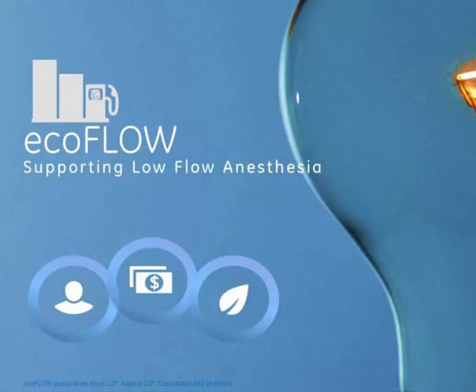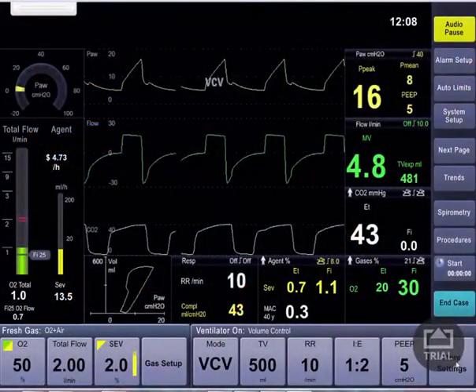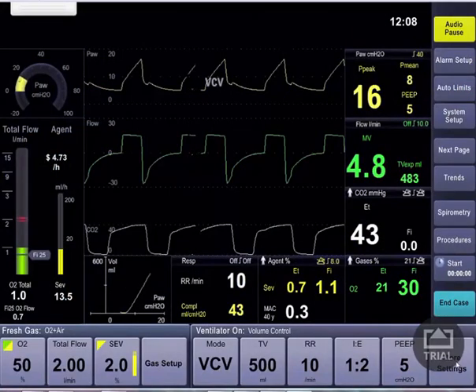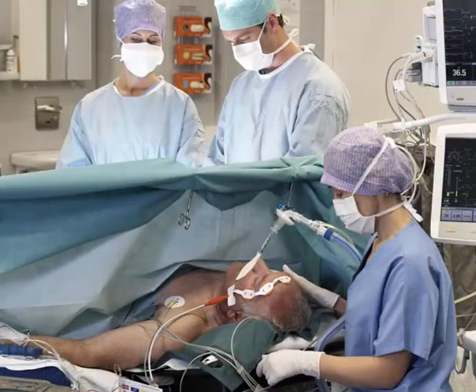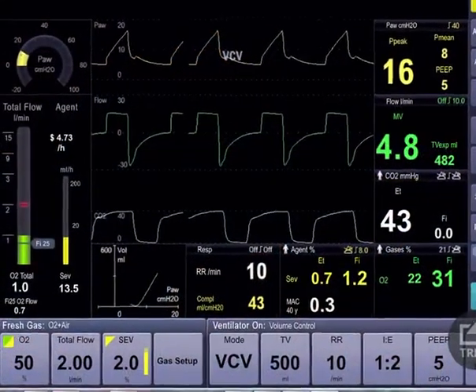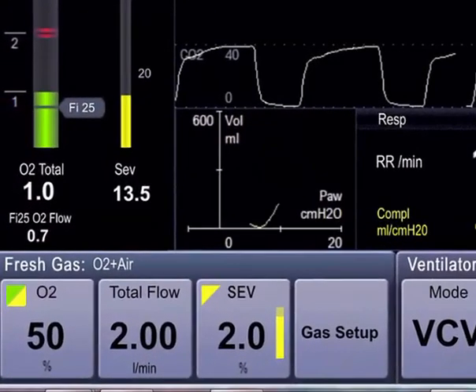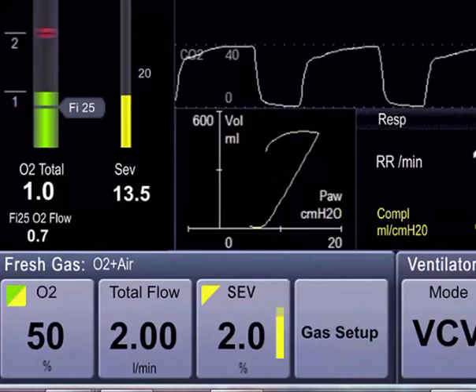ECOFLOW is a software application that helps to facilitate or support the practice of low-flow anesthesia. During low-flow anesthesia, determining the oxygen flow required within your fresh gas flow and maintaining a set inspired oxygen concentration can be challenging. ECOFLOW provides information on how much oxygen is required within the fresh gas flow to maintain a preset minimum FiO2. This information is provided in both graphical and numerical format.